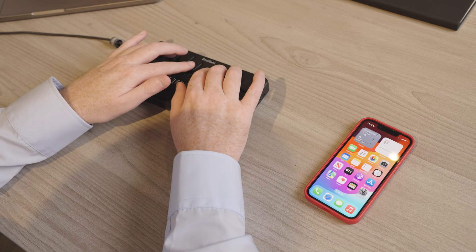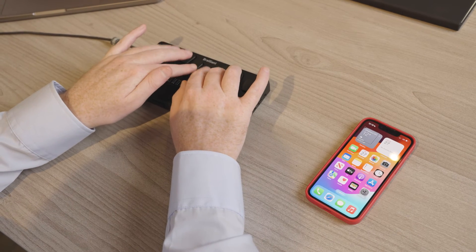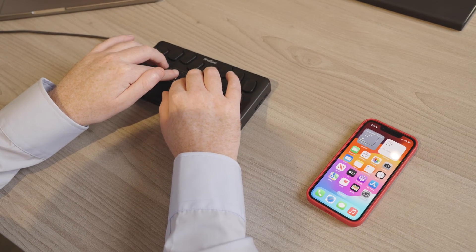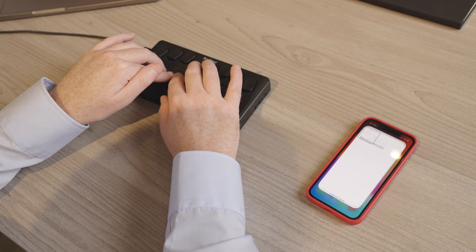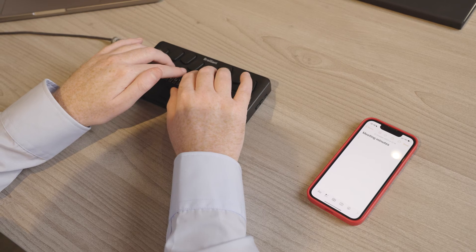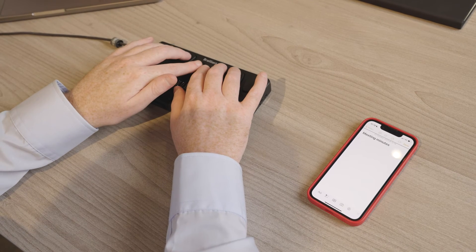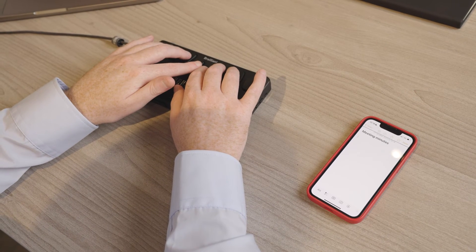To launch apps with your braille display, simply press Return or dot 8 on your braille display. Type the name of the app you want to open, and then press Return or dot 8 again to launch the app.